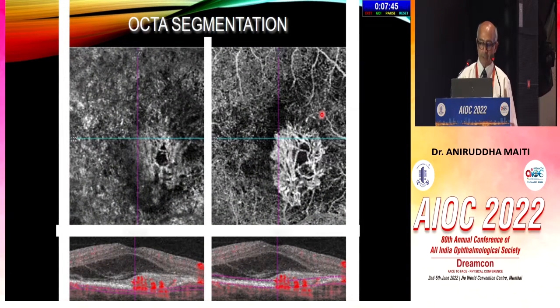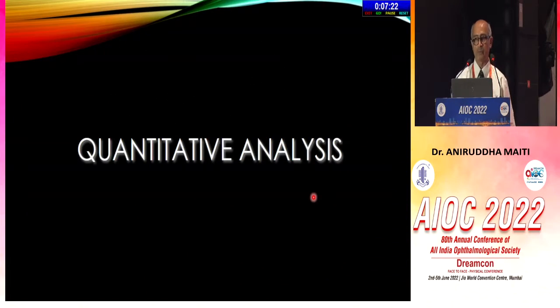So segmentation can be so important, as you can see here, where the 2 lines which are segmenting are in the wrong location and the lesion is not seen. Whereas if the segmentation is done properly, you can see the 2 lines being properly placed, like calipers, and the lesion is well identified. And this is very, very important both to learn to do and in the interpretation of OCT angiography.